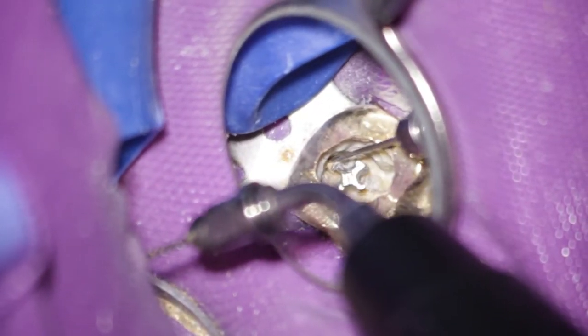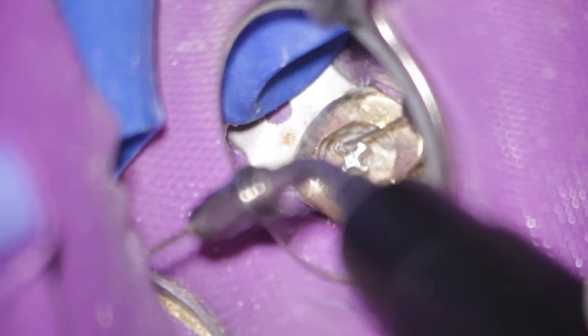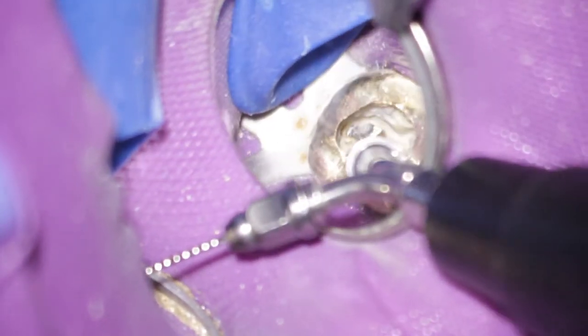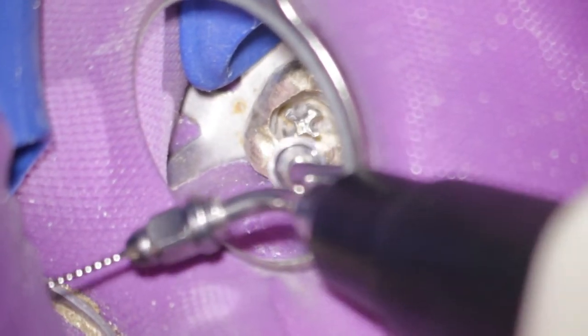So some will say, why don't you screw the post out with the corresponding handle? I have to say that I had not enough space between the crown and the post to place the handle properly, and this is more important to me. I did not want to deliver more stress to the dentine walls than necessary. With a handle you give a lot of power to the post, and the post will give it to the dentine. I didn't want to risk cracks or even a fracture because of being impatient.